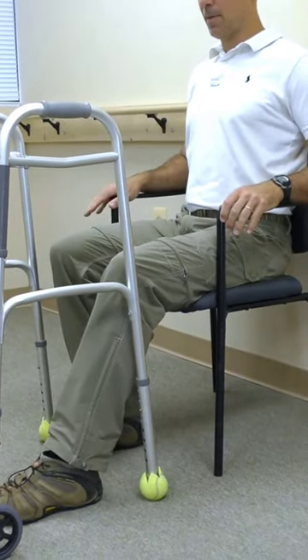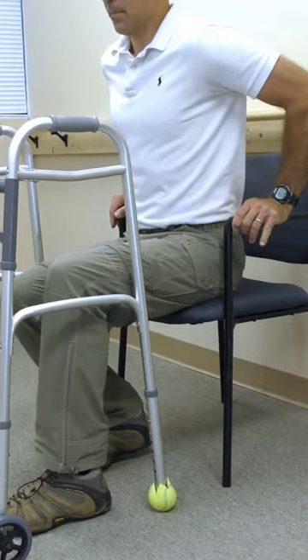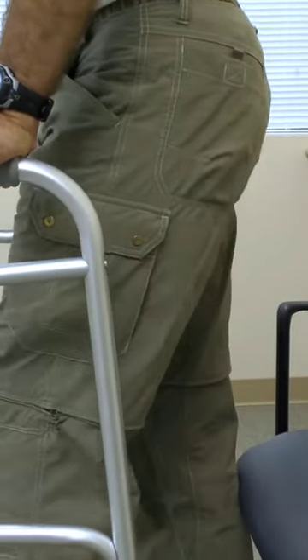Again, do not bend your hip past 90 degrees when sitting, so it is very important to keep your back straight and do not lean forward. To go to standing, reverse the process.